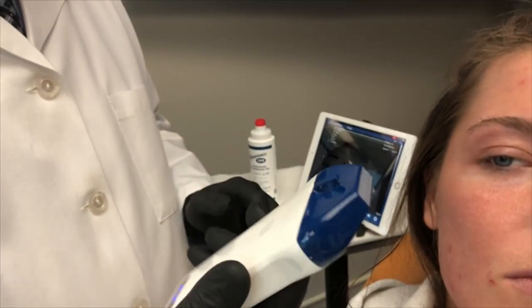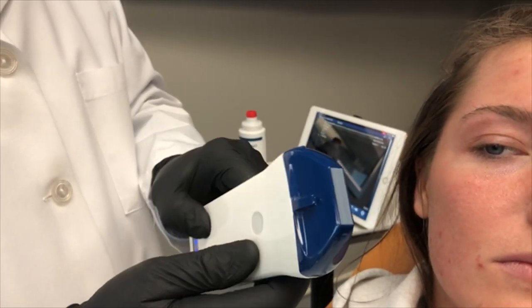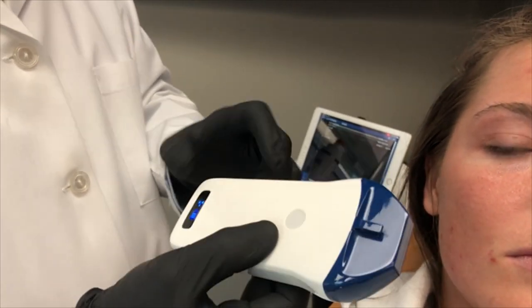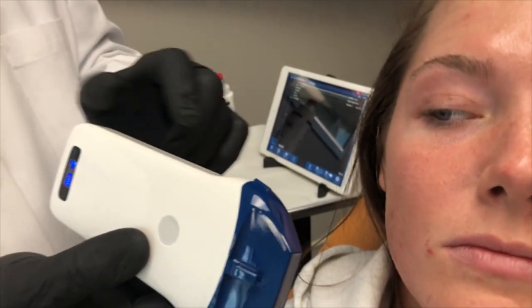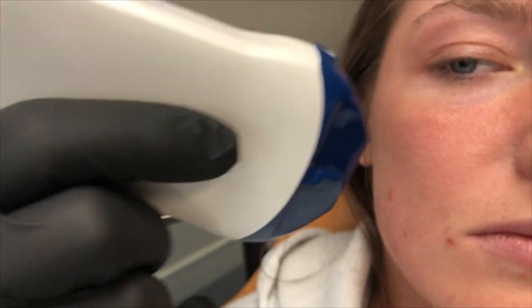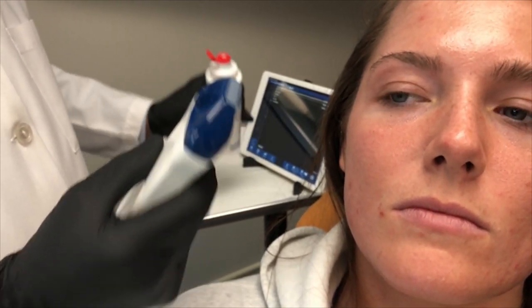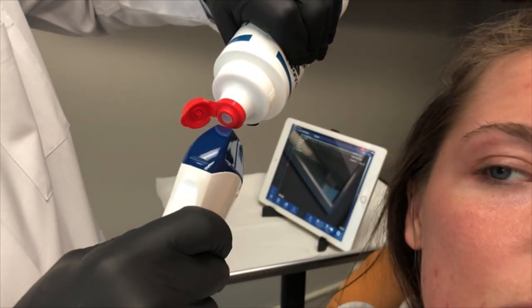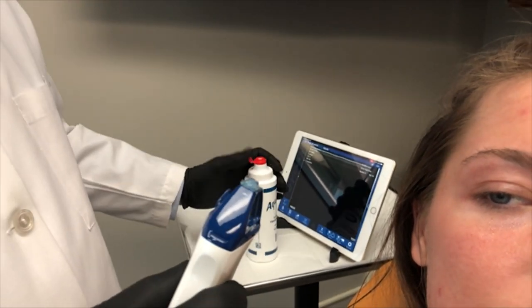Here is the device, and this is the best ultrasound optimized for facial aesthetics. You can see it's small with an integrated battery — it is fantastic. It has this little piece right here that is always going to go cranial, so we know which way it's oriented. We're going to go ahead and put on some ultrasound gel, which is very standard for any ultrasound. Simplest device to use here.